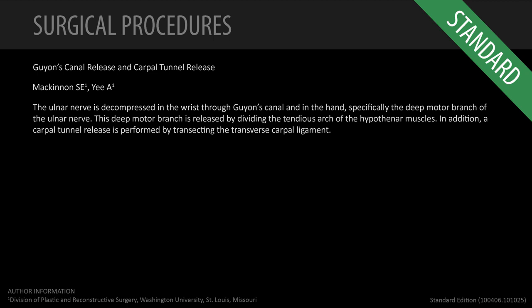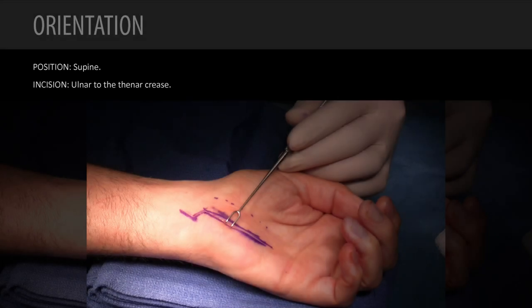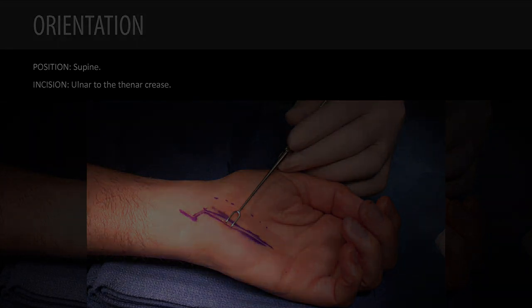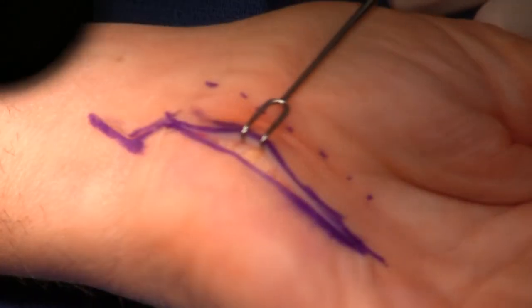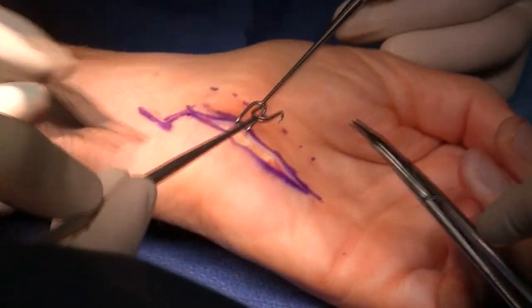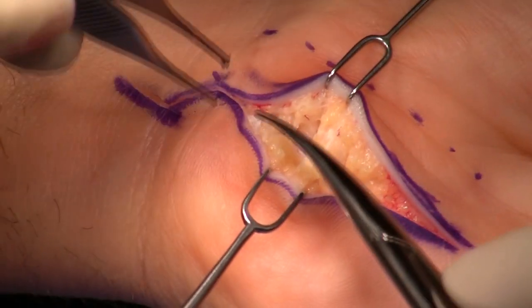This is our exposure to the ulnar nerve through Guyon's Canal, as well as the carpal tunnel. Specifically, we're going to release the deep motor branch. This is the left hand; I'm sitting on the ulnar side of the hand. You'll see the incision we use is very ulnar to the thenar crease, which I've dotted in here. There are very specific points about this Guyon's Canal release.